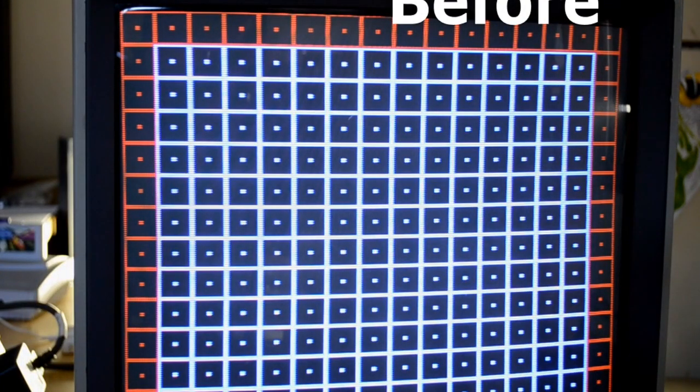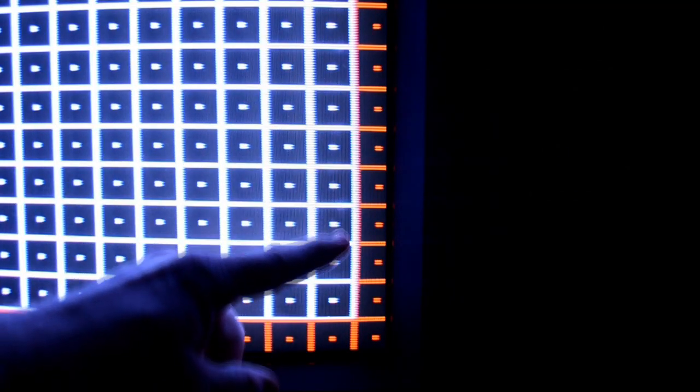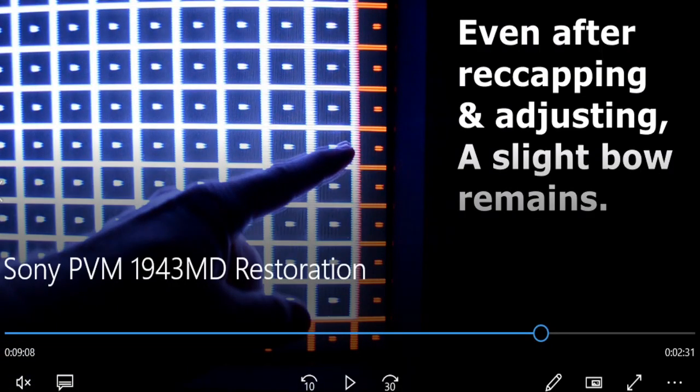I want you to take a very close look over here to the right-hand side of this screen. I'll show you some things that, again, I could not get fixed fully, but this is a before and after shot of the grid now. And the grid is just pushed up to where I like to have it, where the dots are almost halfway between the wall and the screen edge, and your overscan area needs to be somewhere in between those lines. I go through that more in the recapping and recalibration video. But this is something that I had trouble with on this monitor.